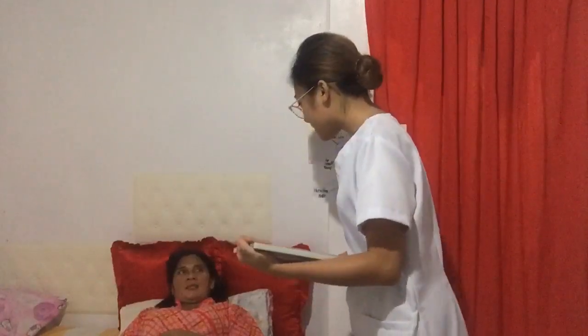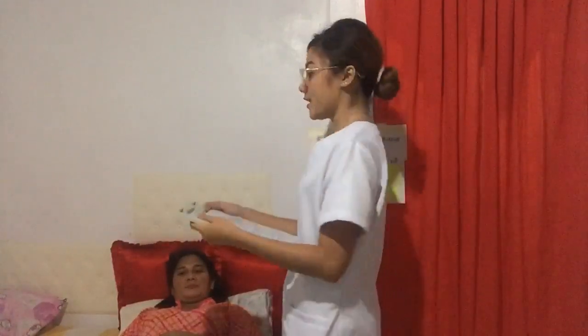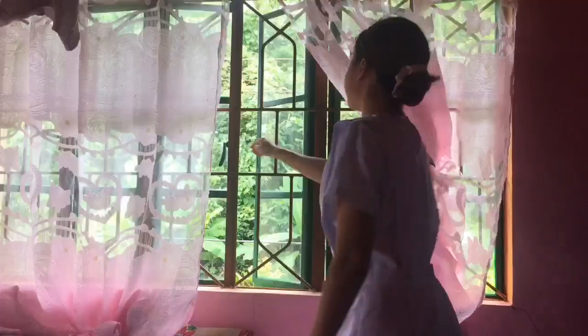Next is to identify the patient. Okay, ma'am, what's your name po? How old are you? 49 years old. Okay, Glenda Balisa, 49 years old. After that, I'm just going to close the doors and the windows for your privacy. Okay.